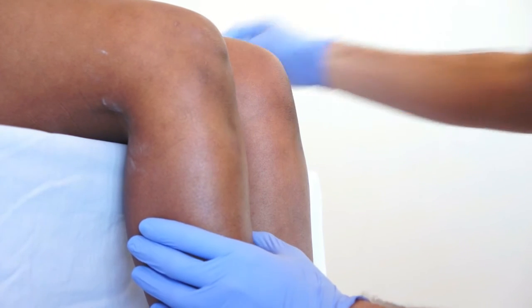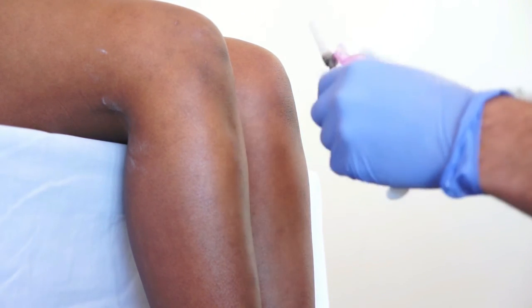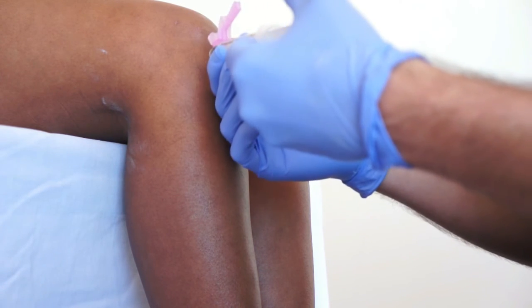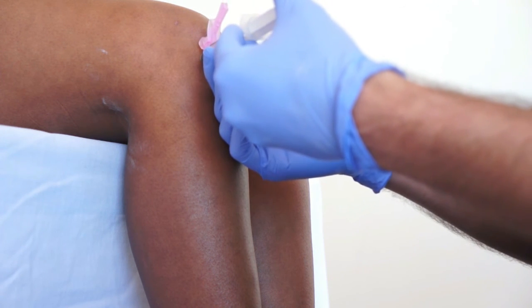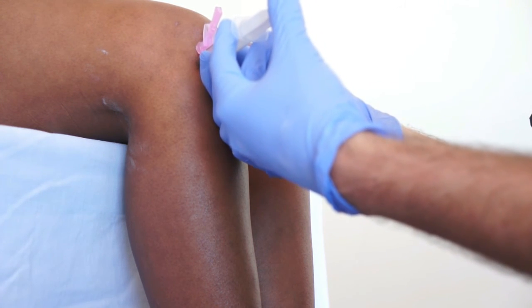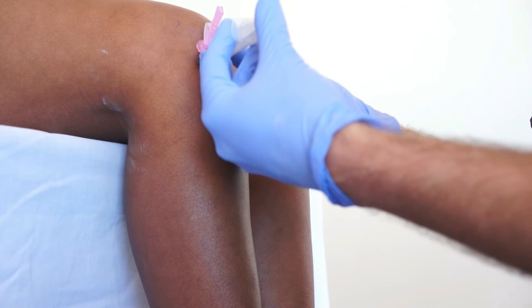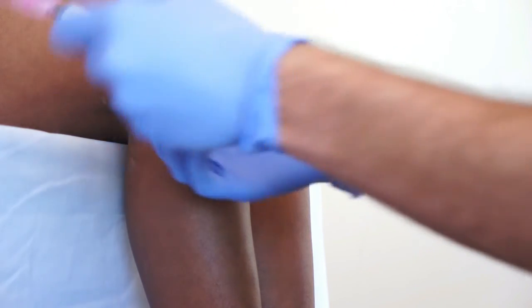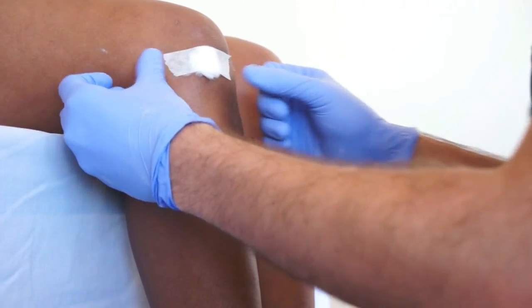Once the area is dry, take the syringe with your medications and insert it perpendicular to the skin at the injection site. Once in the joint space, aspirate to confirm the position and inject your medications. Once you have injected your medications, withdraw your needle and apply compression with the cotton wool secured using the tape. Remember to dispose of your sharps appropriately and thank your patient.